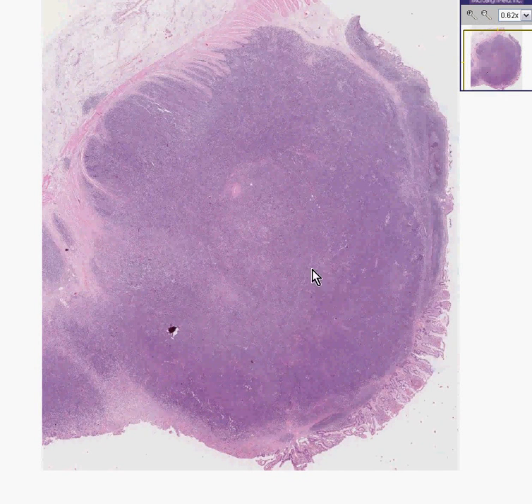Whenever you have lymphoid tissue that doesn't differentiate into normal follicles, or perhaps completely destroys the overall architecture of what a lymph node should look like, and the cells still look like lymphoid cells, either a lot like normal lymphocytes or even a little, you can diagnose a lymphoma.